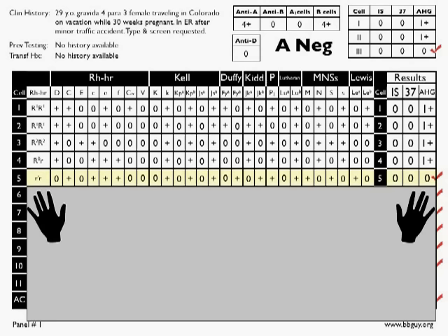Well, let's start right here with Lewis A and Lewis B. Lewis A and Lewis B are obviously a pair, and you can see that this is a double dose expression of Lewis A. We take our pencil and mark a single slash through Lewis A. That makes total sense, right? So with double dose expression, you can go ahead and do a rule out.